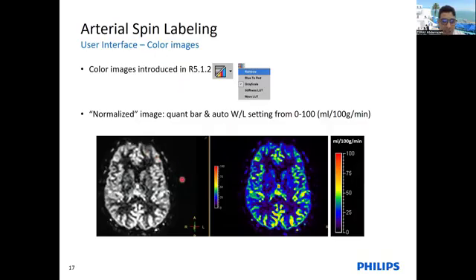So we can modify it, and of course there are different releases in Philips, release 5 or release 4. Now we attend just release 5.7. Even there is a release for the new systems, the Ambition X and the Ambition S, also the addition of release 11 and release 12. So there are different releases, and when you do some post-processing, it depends on the release that you have.